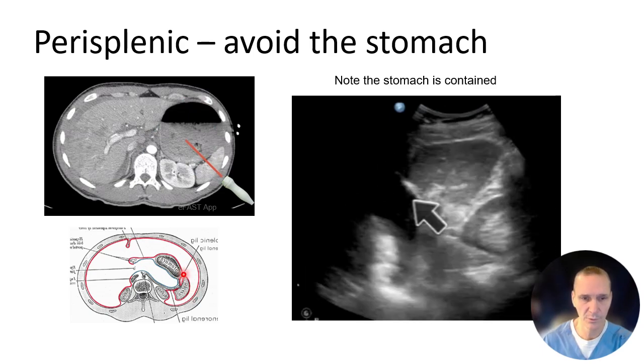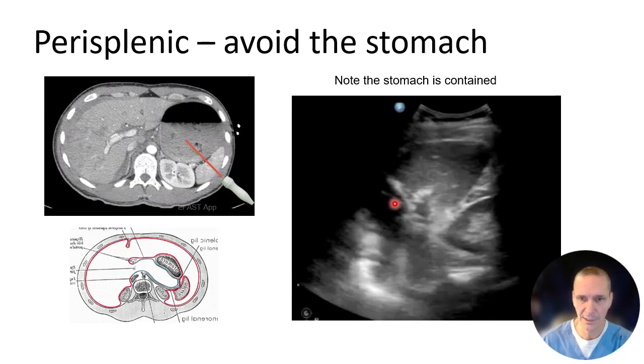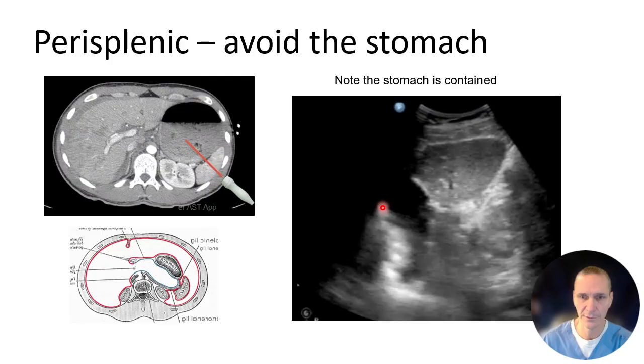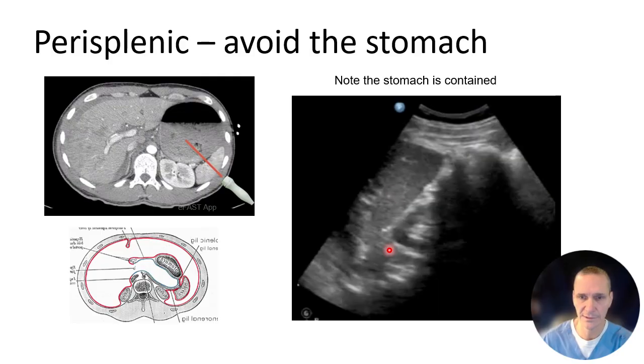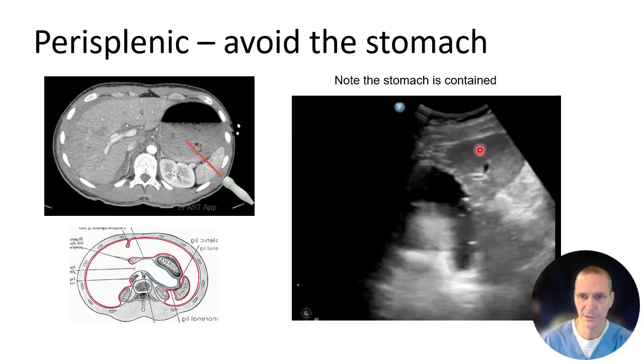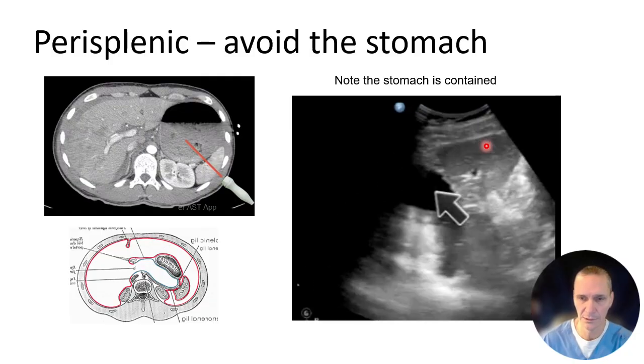And also beware here again, you don't want to catch the stomach. This is stomach contents here, and that can be confused by early learners as hemorrhage, when in fact it's not hemorrhage. Bleeding, we'll show images of this. Bleeding would be in this area here, most likely.